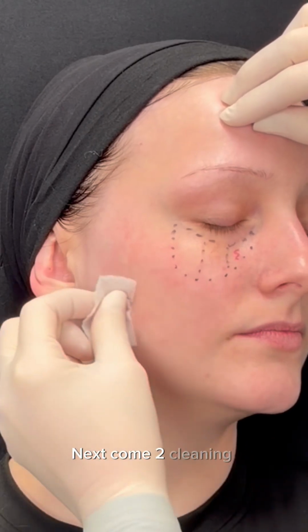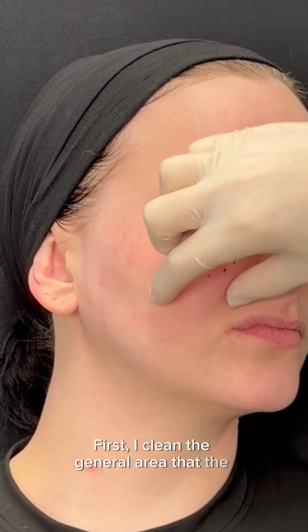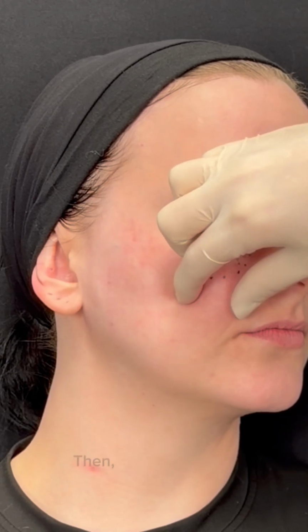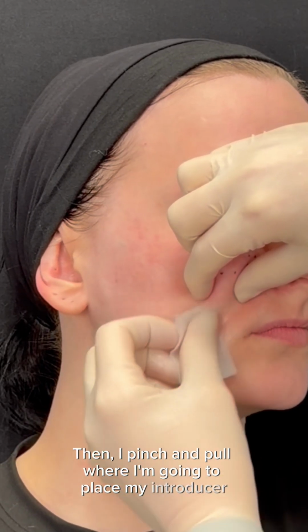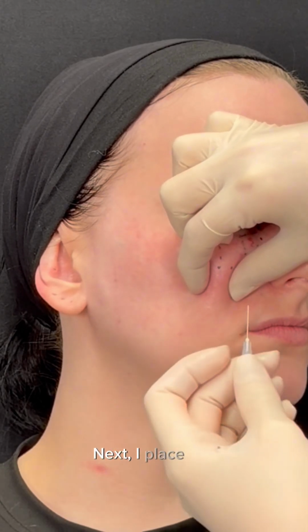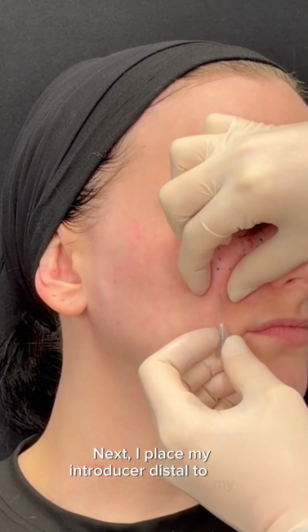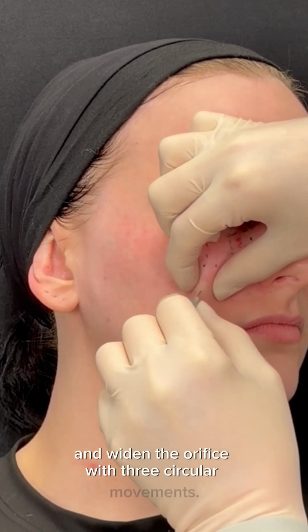Next come 2 cleaning steps. For cannula injections, first I clean the general area that the cannula can touch the skin. Then I pinch and pull where I'm going to place my introducer and clean the introducer entry point. Next, I place my introducer distal to my pinch and widen the orifice with 3 circular movements.